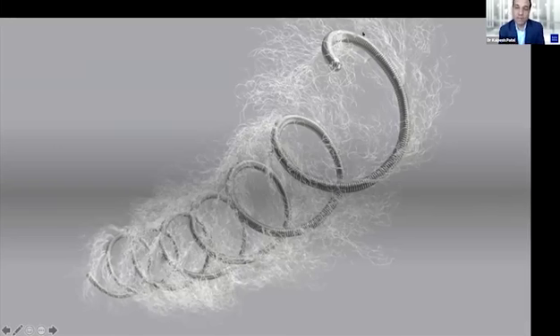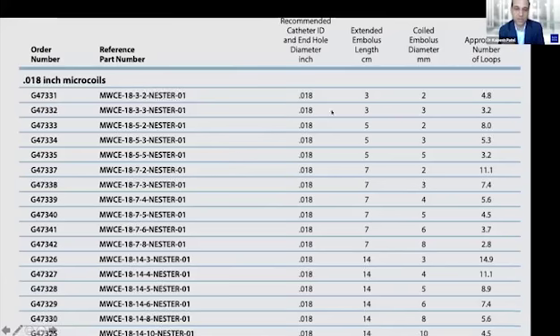So these are platinum-based coils, and they are coated in these microfibers or hairs. And the idea is that these induce thrombus within the varix itself, more so than just having a bare coil. And so by creating a network or a conglomeration of these, we can induce thrombosis within the varix and then glue to fill in any of the spaces in between.